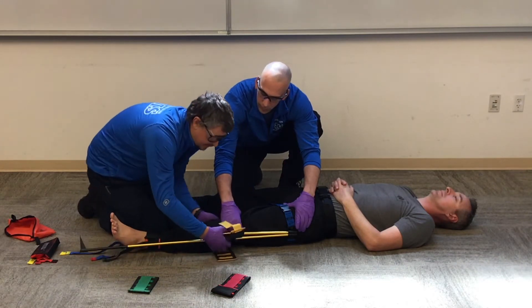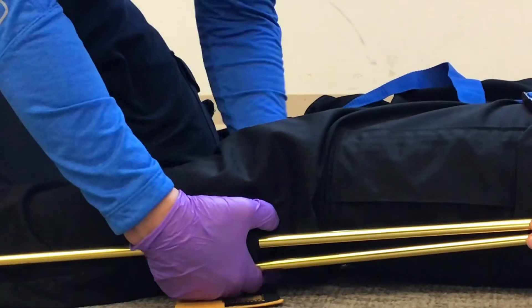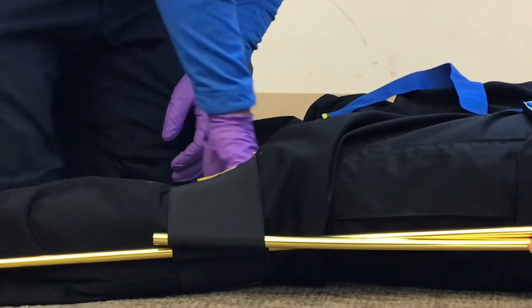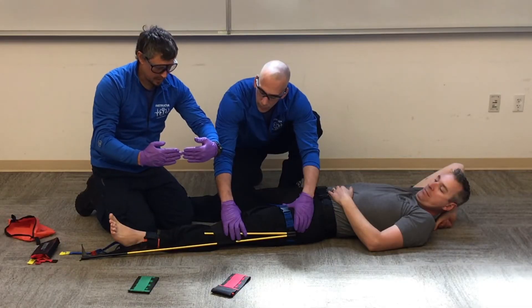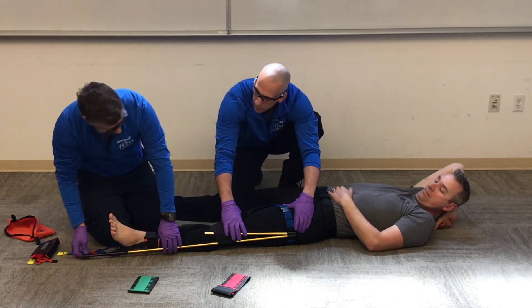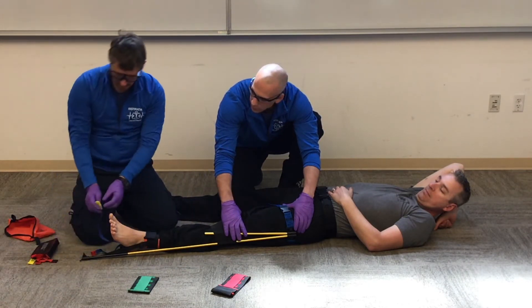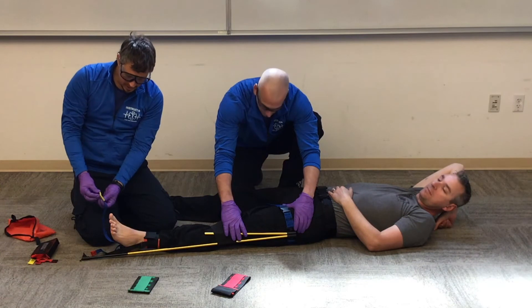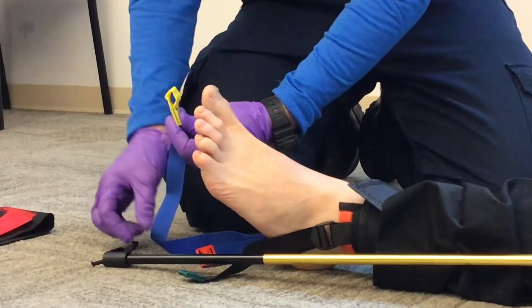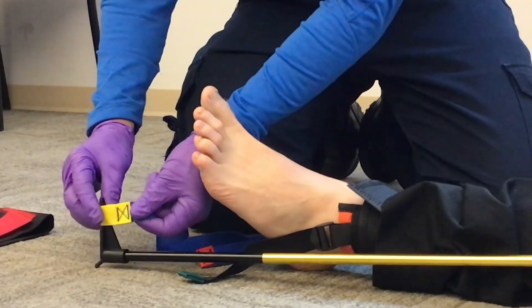For the KTD I'm going to secure the middle strap around the knee. That's going to help hold the tent pole secure as I pull traction so they don't bow out. Once I have my device secured to the side of the leg, I'm going to take my yellow webbing — there's a loop inside of it — and that loop is going to go over the boot hitch of the traction device.